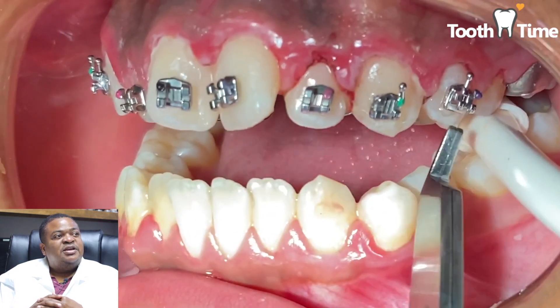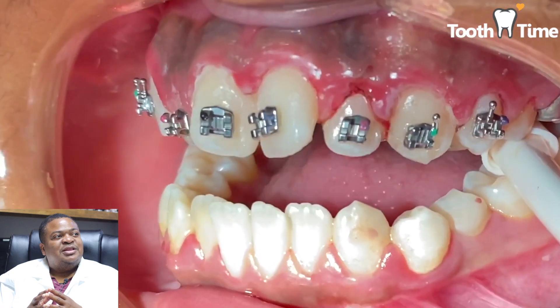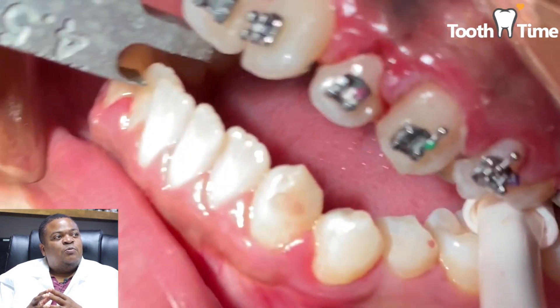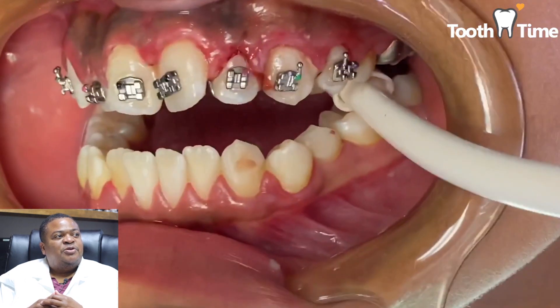Here we're just putting on the brackets and we only want to put them on the top right now. We just want to get some of this initial alignment, and once we get them going and start progressing the case, we'll be back with you to do some more updates and show you what things are looking like.